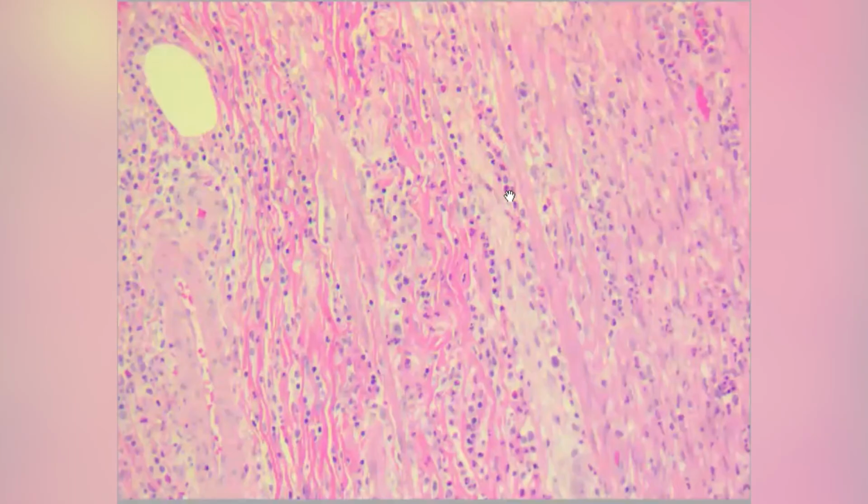Let's go at 20x. So this is the muscularis propria, and as we can see, we have some, or many actually, neutrophils present. These are all neutrophils. So this is acute inflammation. This is another neutrophil, and I think you can appreciate more and more neutrophils present in the muscularis propria. And this is diagnostic for acute appendicitis.